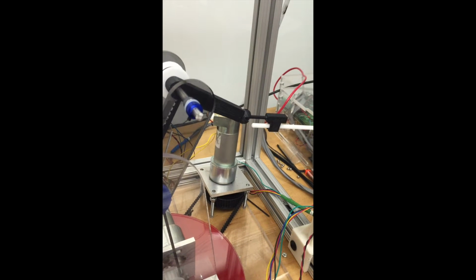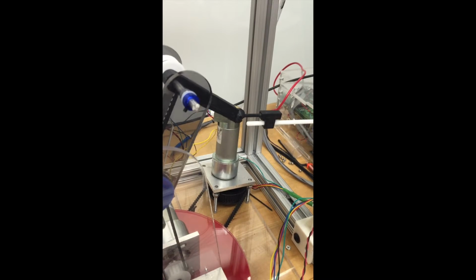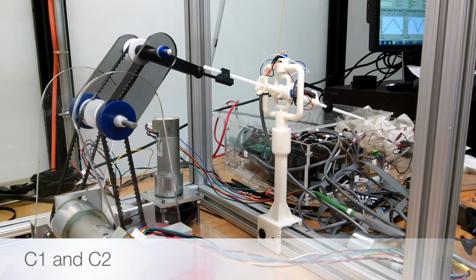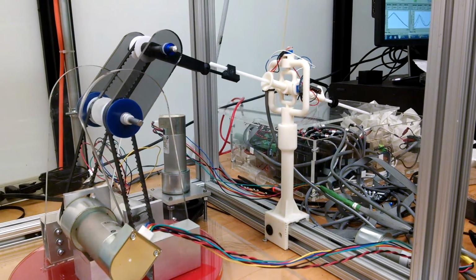The 3 independent degrees of freedom, X translation, Y translation, and Z translation, required to control the arthroscope, are achieved by actuating all 3 revolute joints simultaneously. This path is C1 and C2. It demonstrates inserting and extracting a needle.